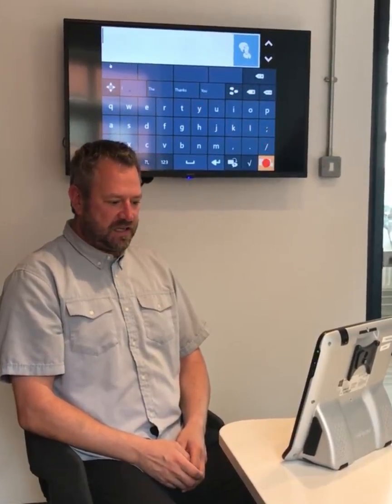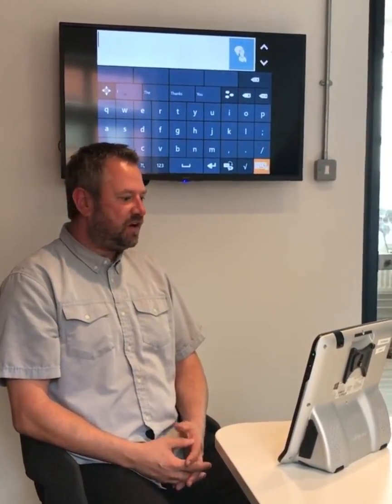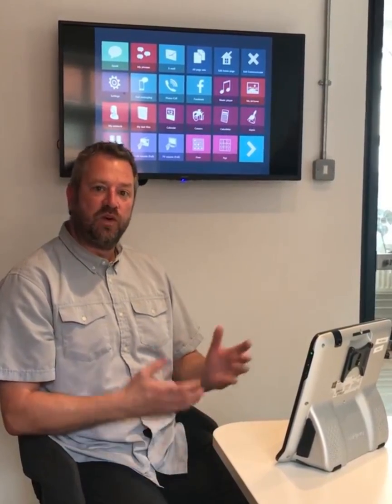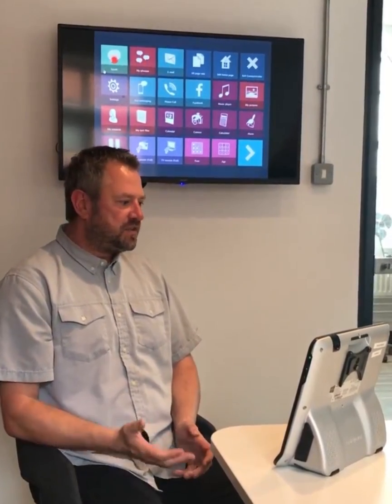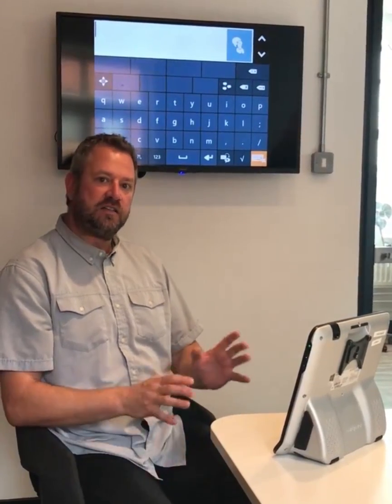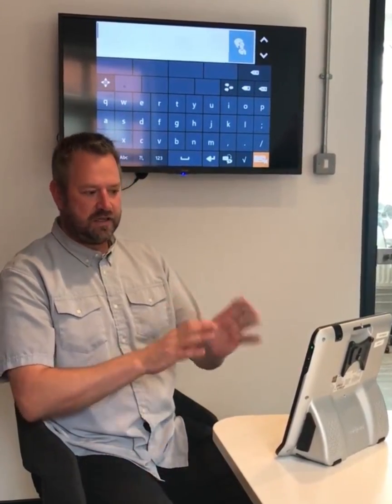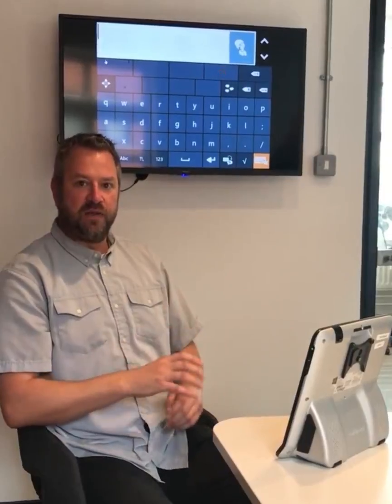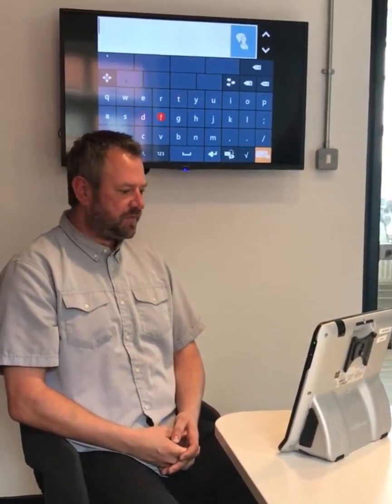You can see when I go to my home page in Communicator 5, as I navigate my way around, I've got a dwell time that doesn't pressurise me to make a decision quickly because I'm working out where I want to go next. When I come in to speak, my dwell time takes me in there nice and slowly. So if I've made the wrong choice, I can get off there without accidentally hitting the wrong button.